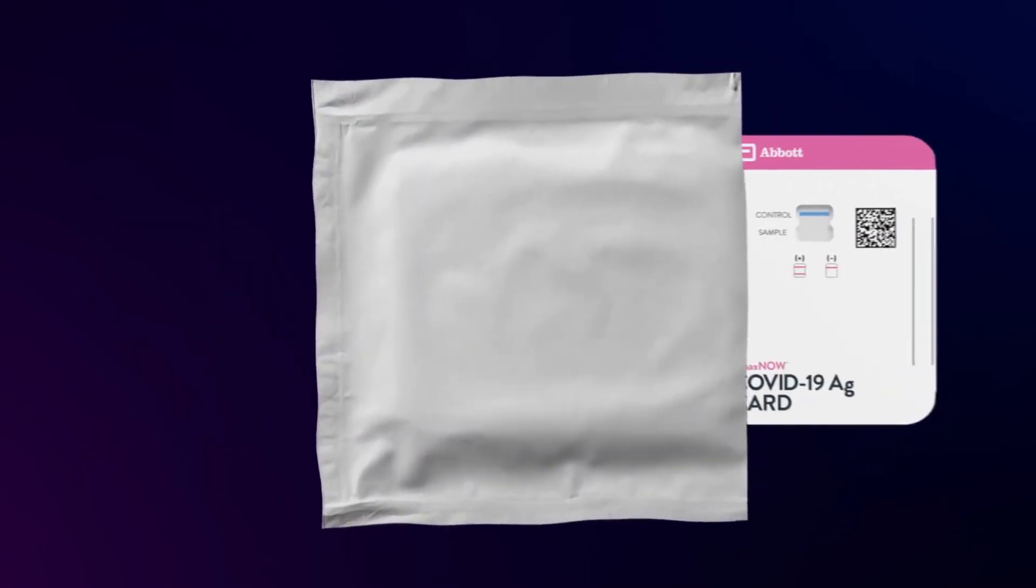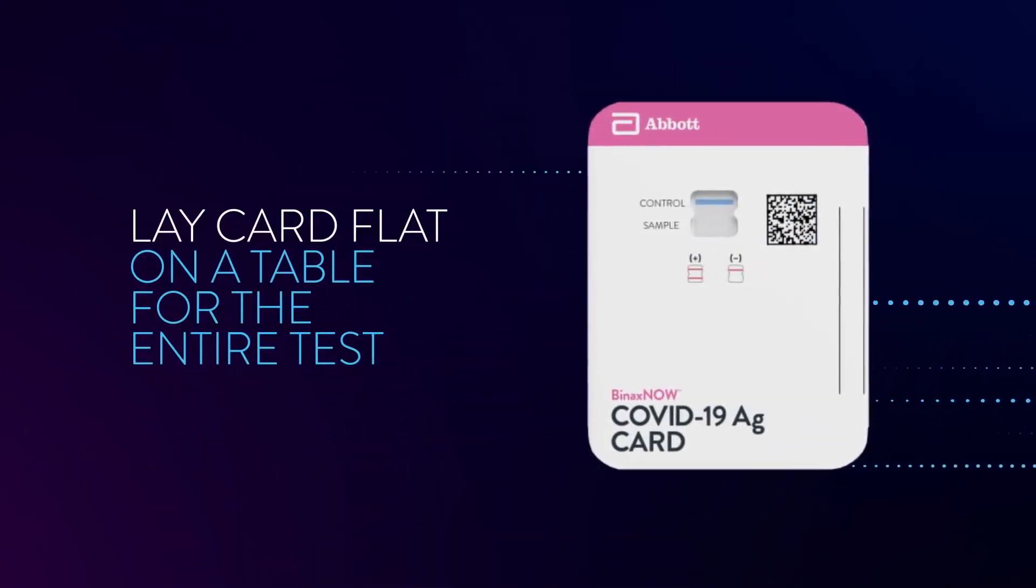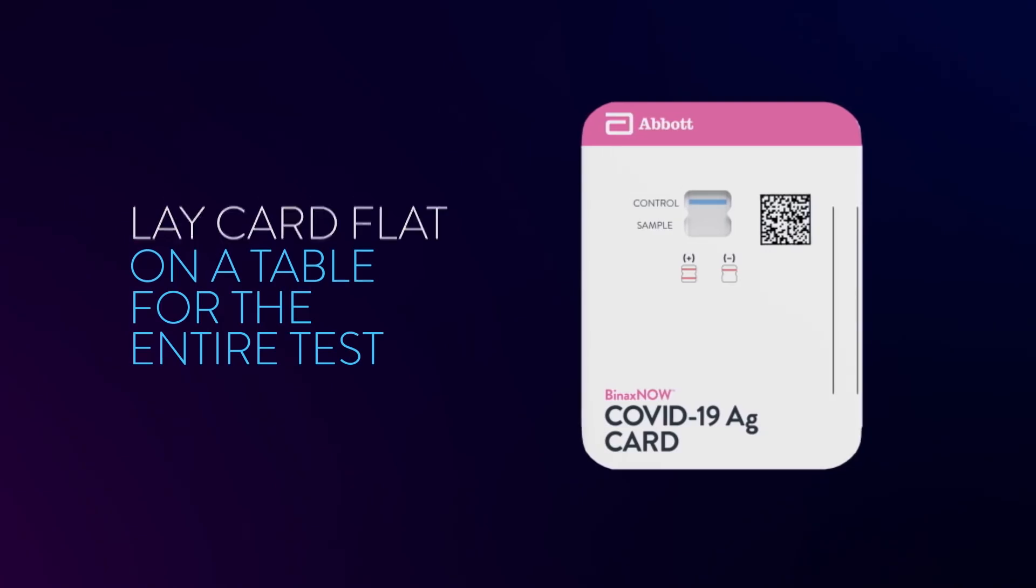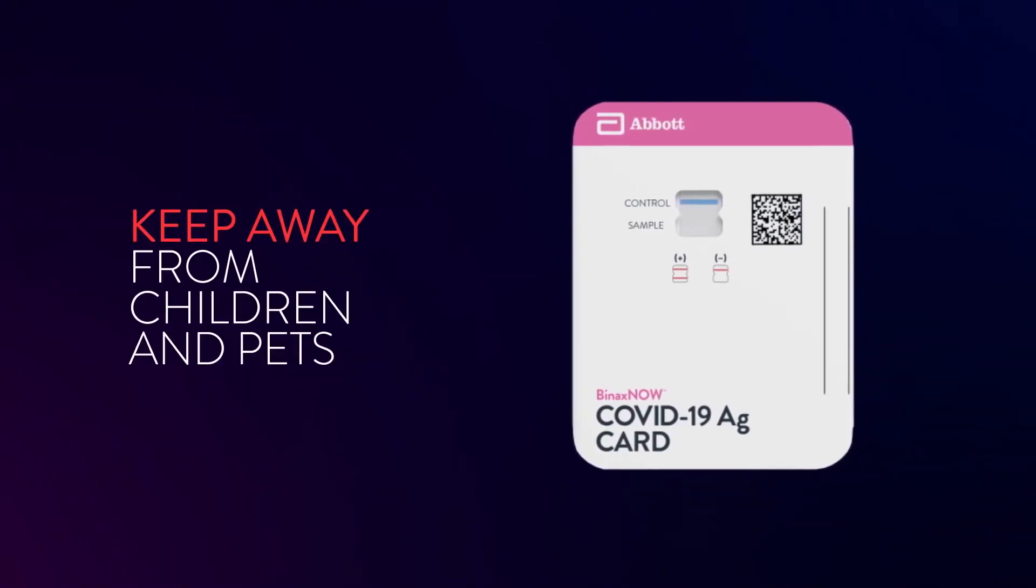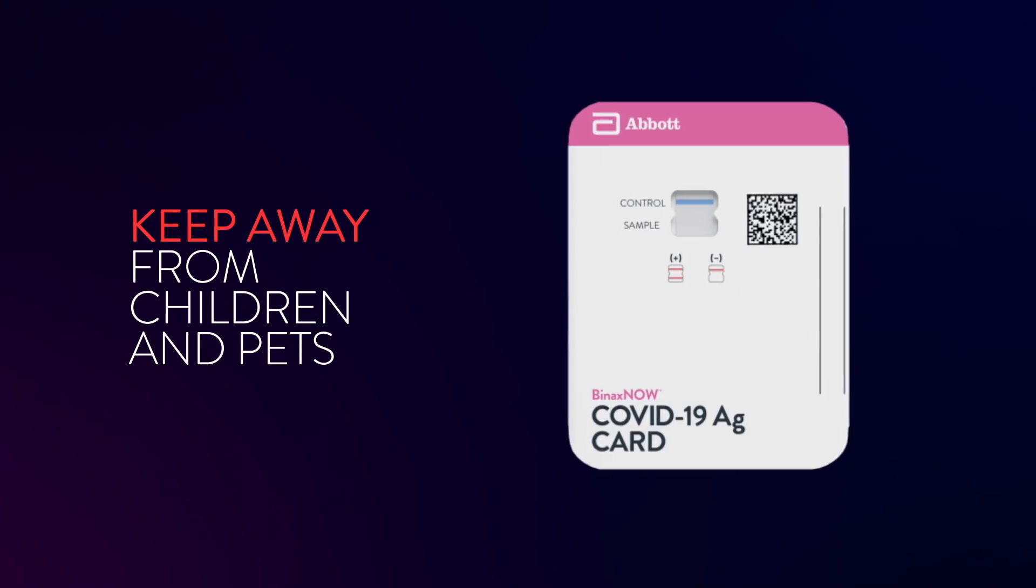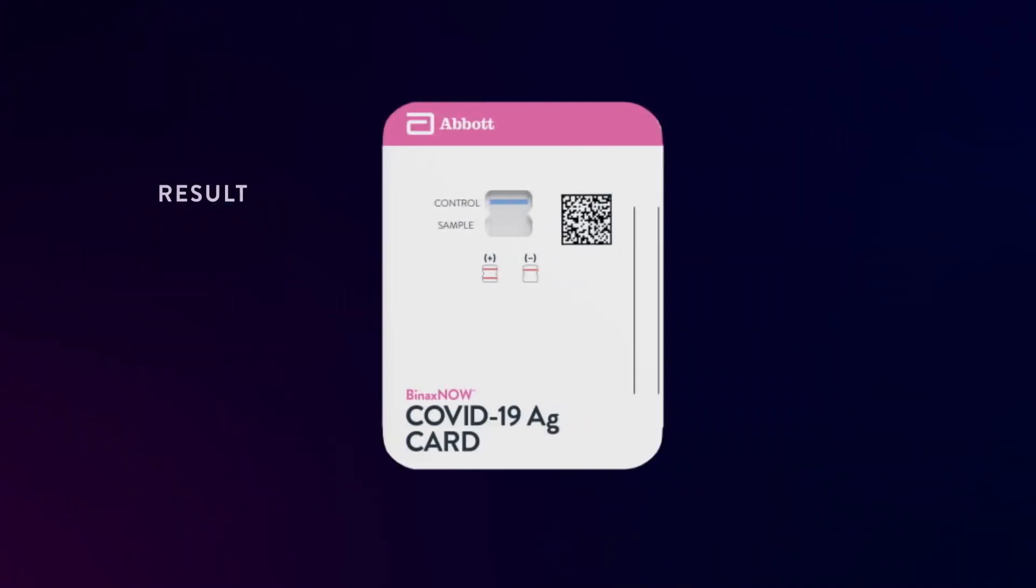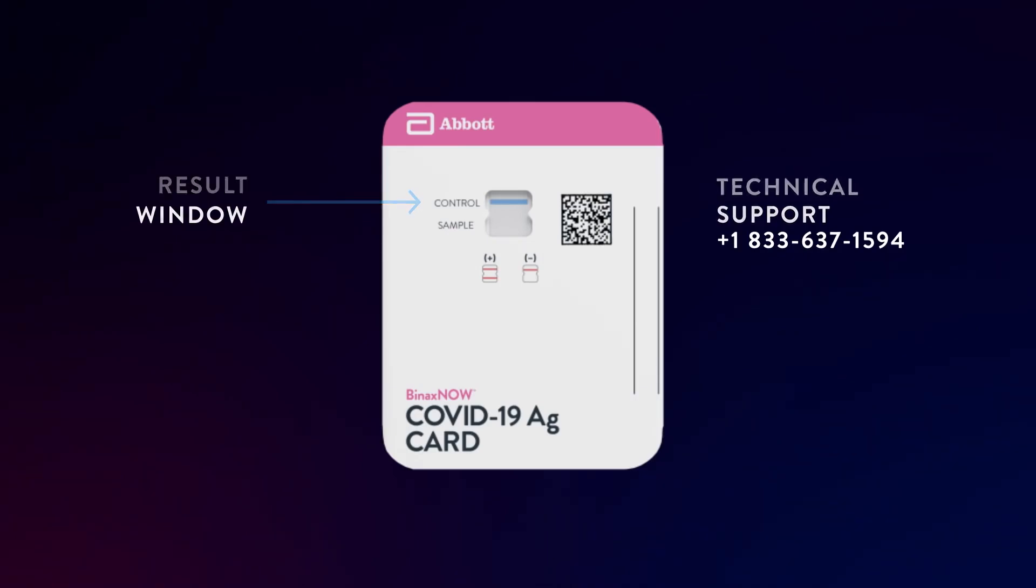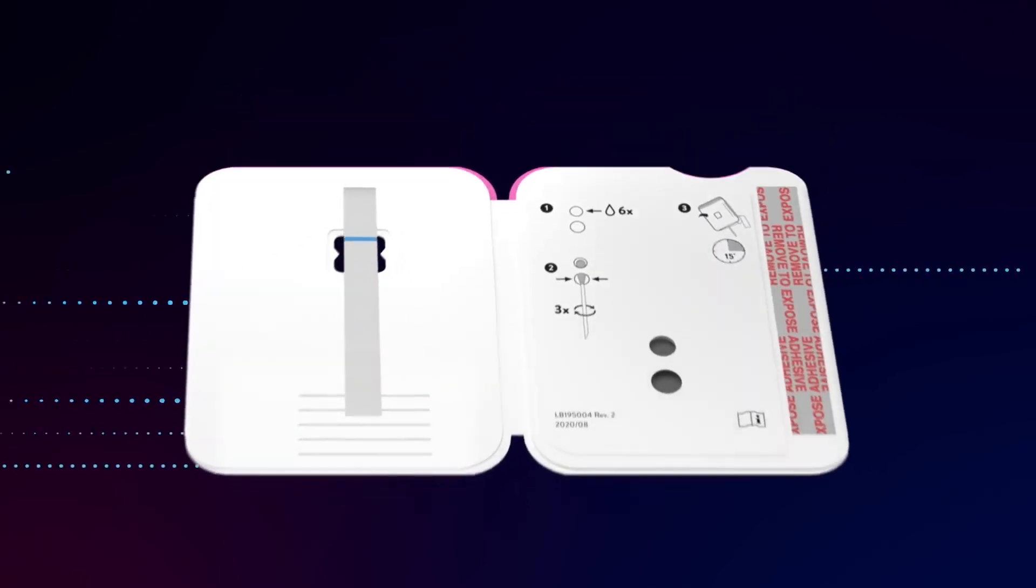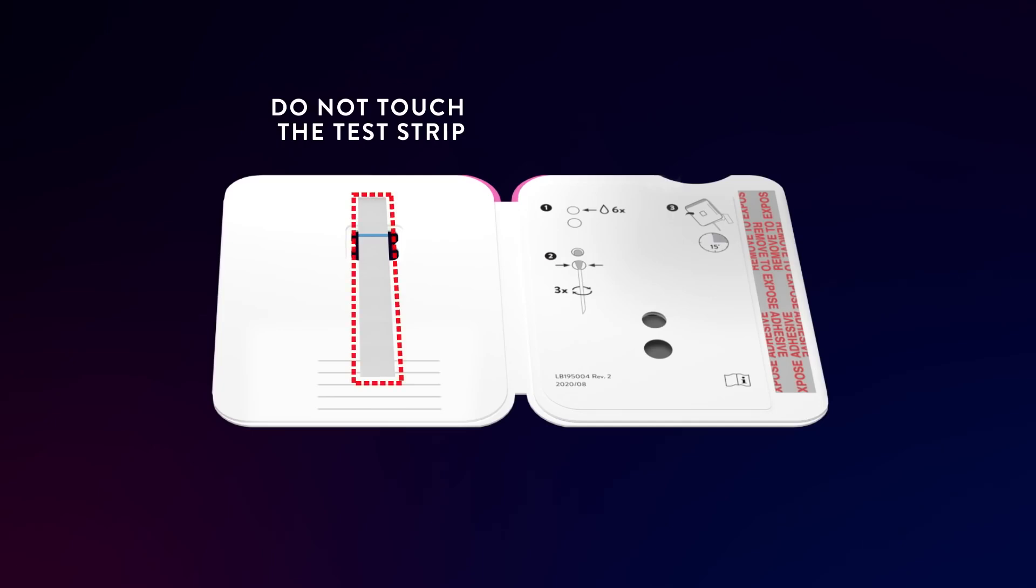Remove the test card from the pouch and lay it flat on a table for the entire test. Keep testing kit and kit components out of the reach of children and pets before, during, and after use. Make sure there is a blue line showing in the result window. If you don't see a blue line at the control position before starting the test, do not use the test card and contact technical support. Open the test card so it lies flat on your table. Do not touch the test strip.